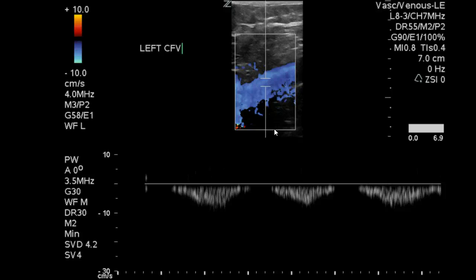The takeaway for this exam — the impression — would be that there is a negative DVT for the right lower extremity, positive for superficial thrombophlebitis of the right calf. You can also say that there is a patent common femoral-sapheno-femoral junction.